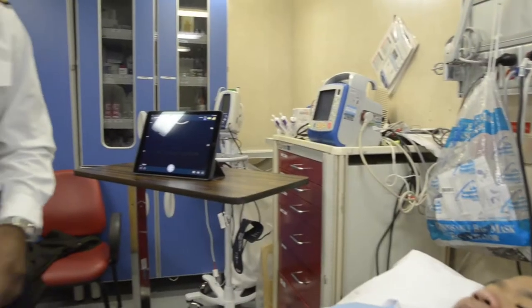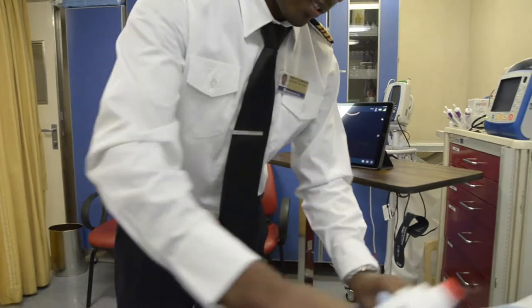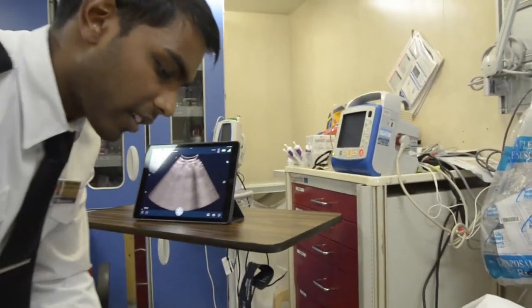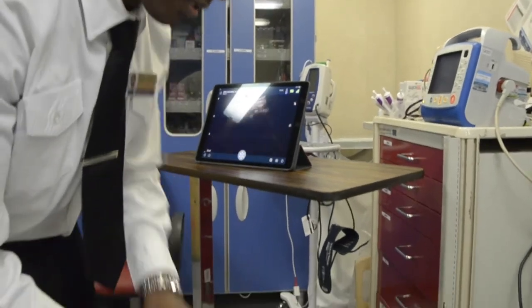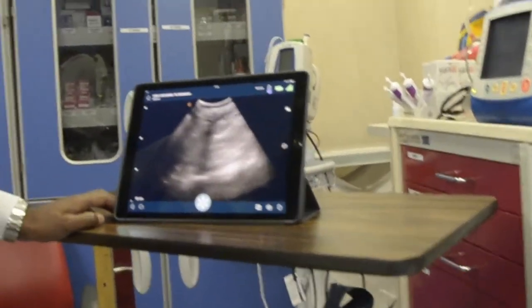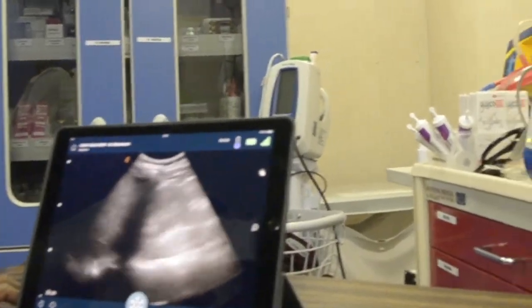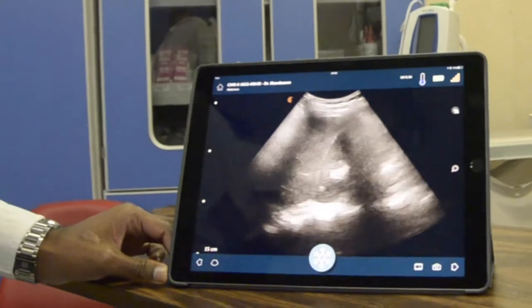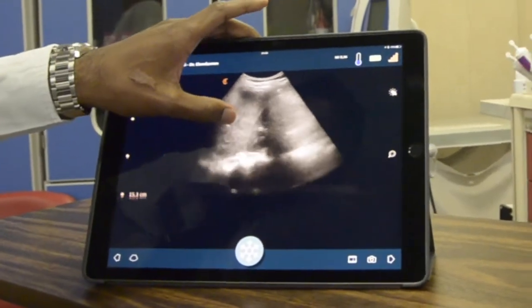Let's have a look — we're going to do your abdomen quickly. As you can see, this is very smooth real-time imaging. You can see here we can adjust the gain and the depth.